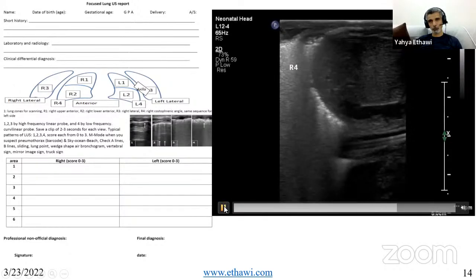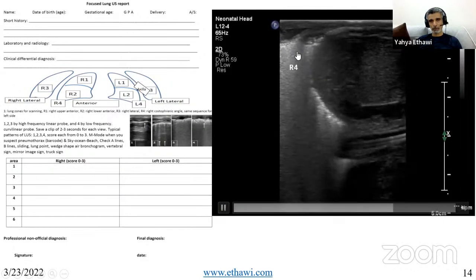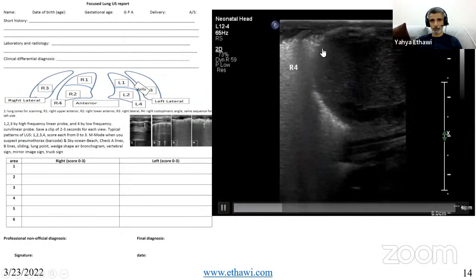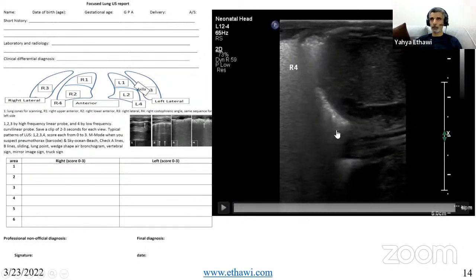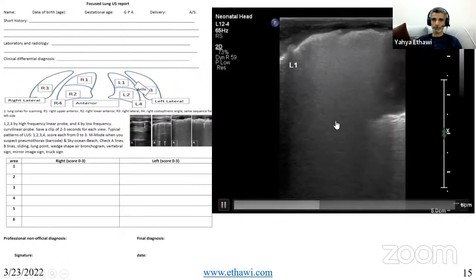There is no pleural effusion. The pleura is moving, sliding, and there are more B lines, with loss of A lines. We don't know where the pleura is, but I agree there is lots of air bronchogram without boundaries, and you can see here also thickened diaphragm without boundaries. So the possibility of pulmonary hemorrhage is there, but it's very hard to say. Let's go to L1.